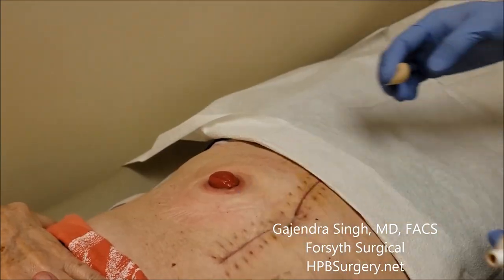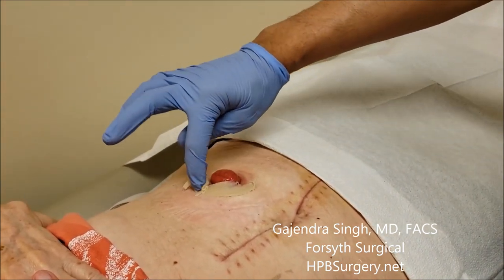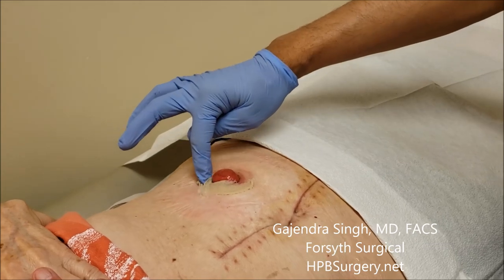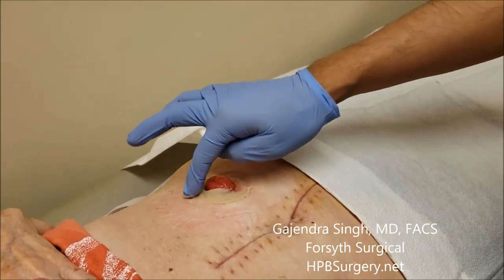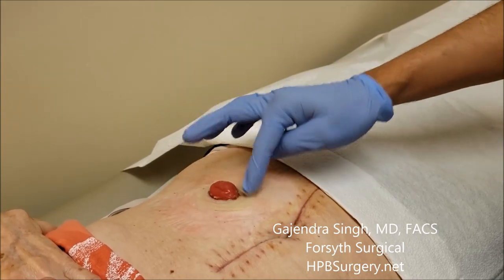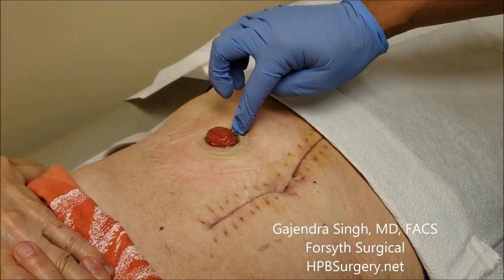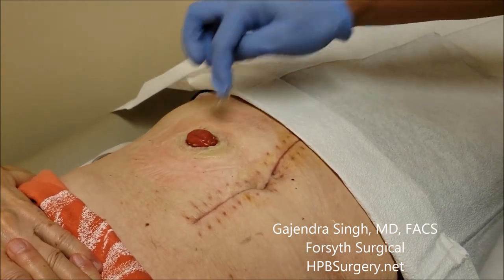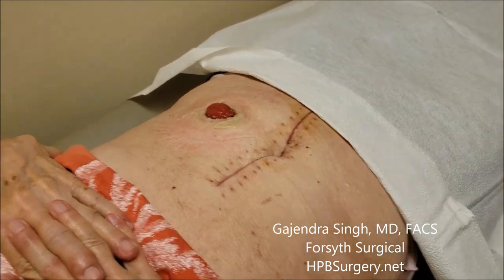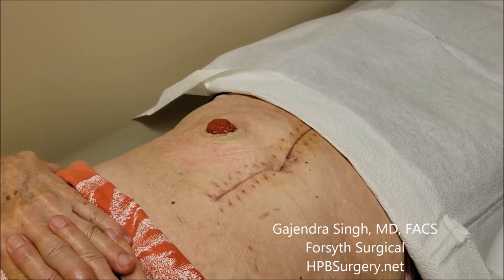This is an Adapt paste — it's a little sticky substance. We're just going to put a little bit of it around the stoma on her skin. Ostomy changing is a little art — you can do the same thing in different ways, so figure out what works best for you.